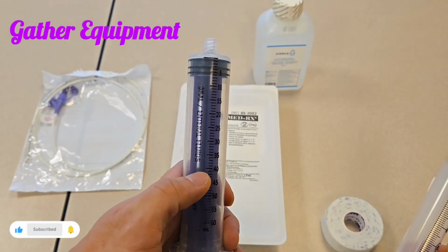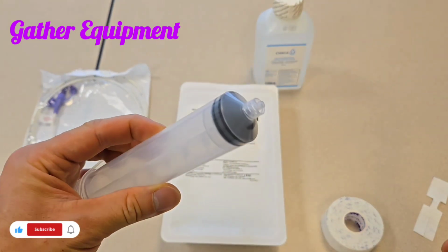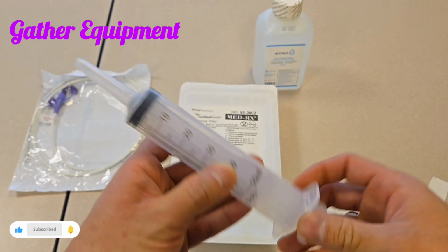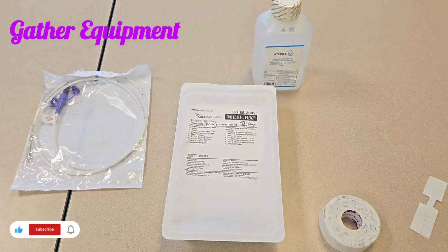We have this one, the purple one, which is only for the feeding tube because purple to purple. This is your luer lock syringe, and this one is for IVs. They will not fit into that one. And the other one is where we have the piston, and these ones are for NGs that can actually allow the feeding for this. All right, team.